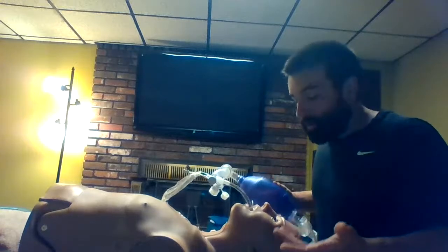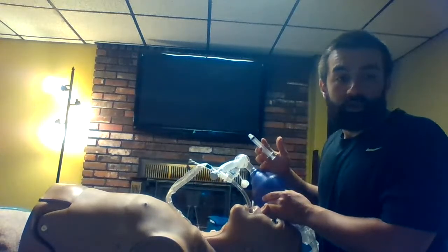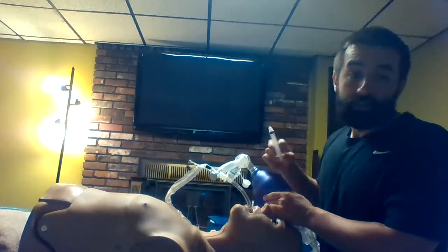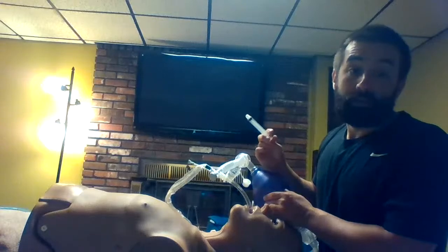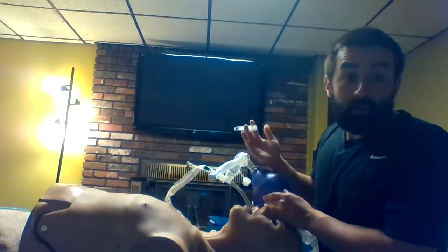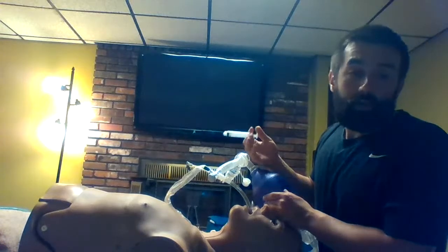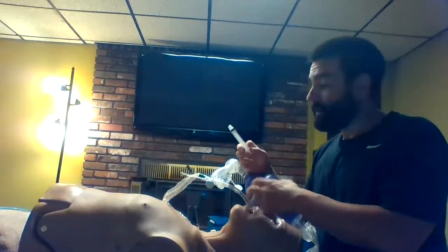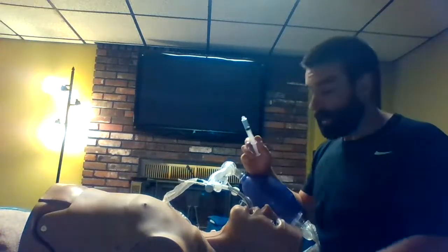Leaks can happen for a bunch of different reasons. The first thing we try to do is treat the most obvious thing, possibly just that the cuff needs reinflated. Sometimes these things might have a slow leak, maybe the tube's a little bit positional, maybe swelling's going down or something like that, or quite possibly the pressures are up on the ventilator and just making it a little bit more noticeable. So you're going to draw back on your 10cc syringe.